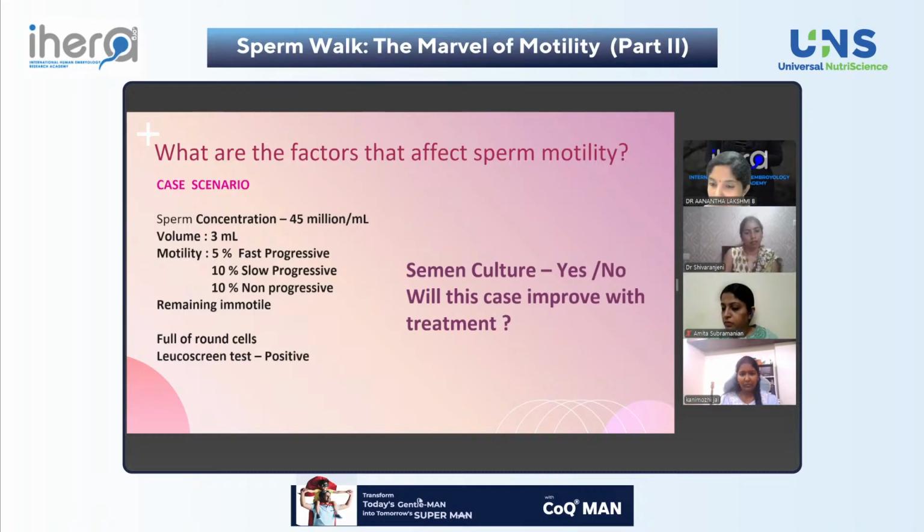And we are doing and recommending semen culture in those samples where there are more than 1 million in that particular sample. All samples we are not sending for semen culture. Yeah, some labs routinely do that. So any difference in opinion?